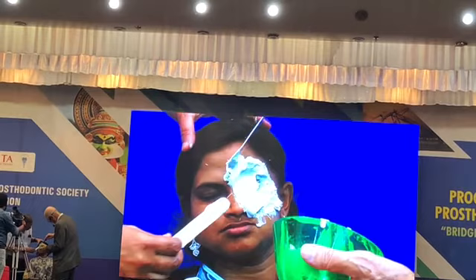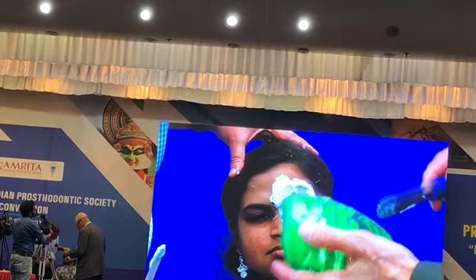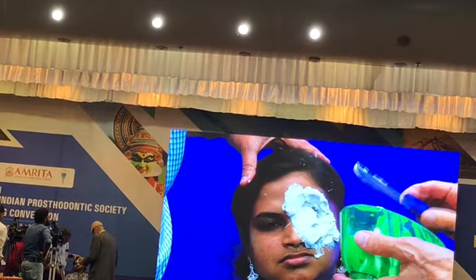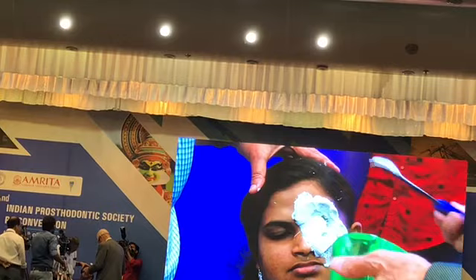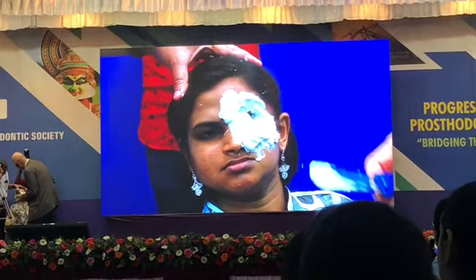See, we need to just leave it. Don't touch that up there. Just leave it. Whoops! There goes some. There's some material in the wrong place. See, now you can apply as much as you want, and you won't distort the impression. So I'm just going to let that set a little bit.